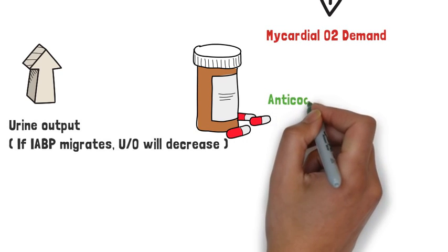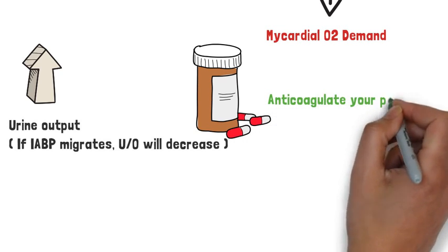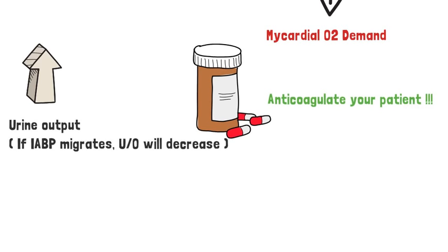The balloon pump is thrombogenic, so always make sure that the patient is anticoagulated and never switch the balloon pump off.